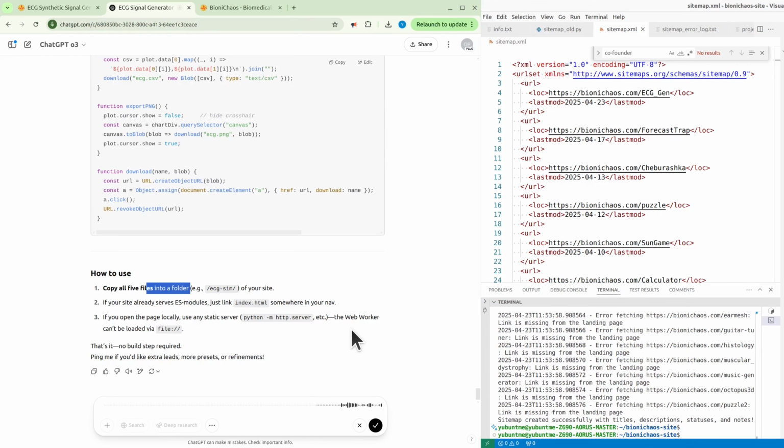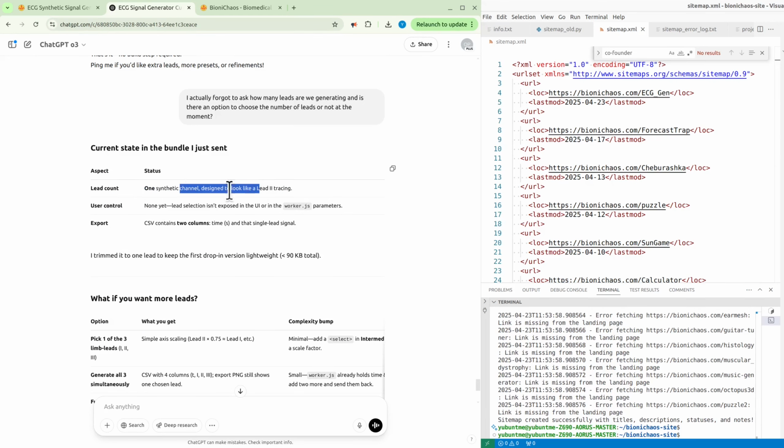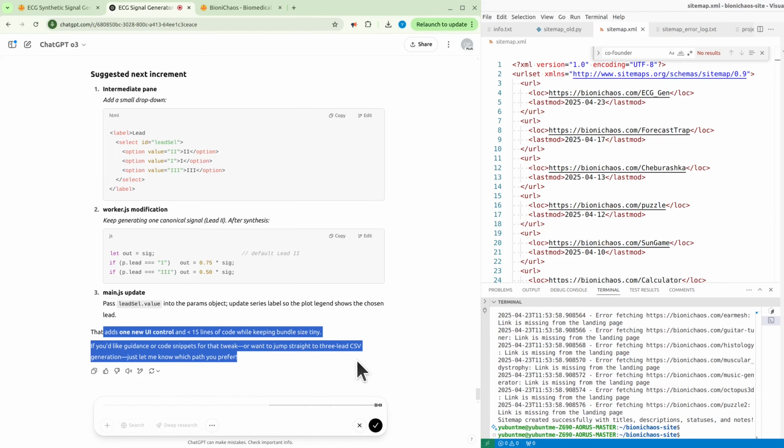Actually, I forgot to ask how many leads we are generating, and is there an option to choose the number of leads at the moment? Currently we're only doing one synthetic channel, designed to look like lead 2 tracing. The CSV has a time column and the actual data column. Now, can we generate 3 or 4 leads? Say 3 leads, 1, 2, 3 to begin with.